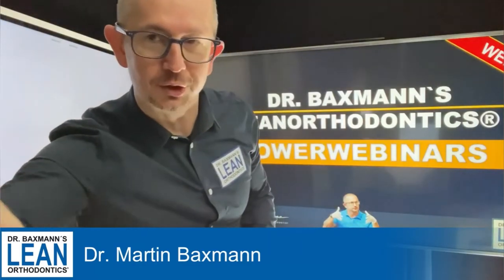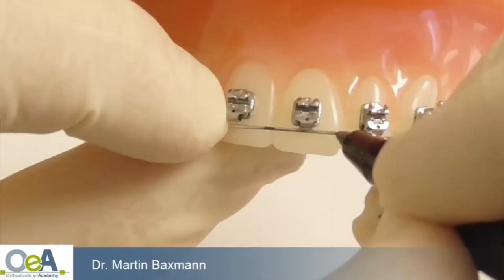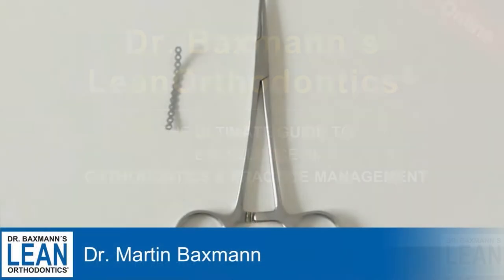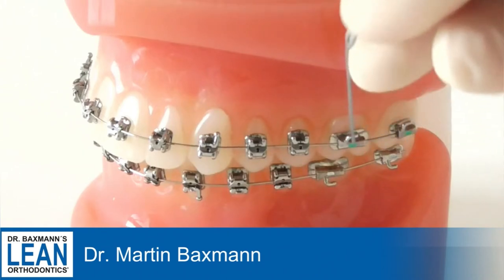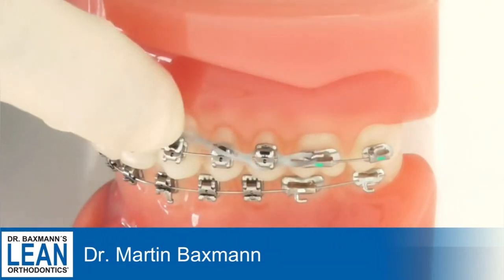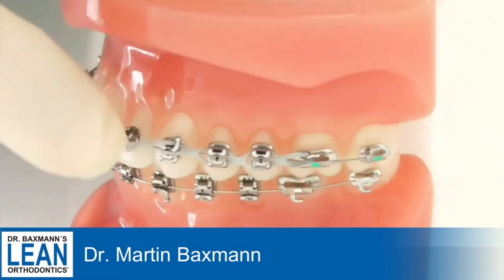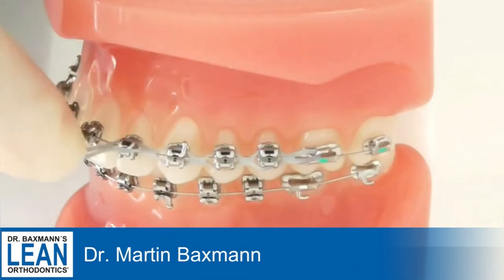In a straight wire technique — and especially in a 022 slot system on 17×25 or 19×25 stainless steel wires — the power chain is the one tool to go for when you want to close spaces. It's so efficient and so good to place really fast.